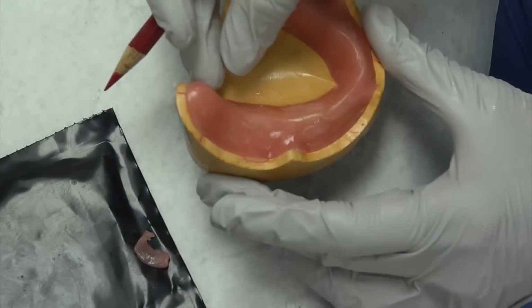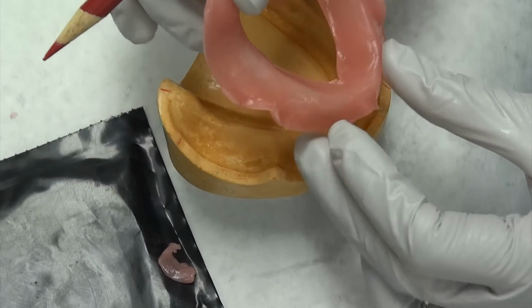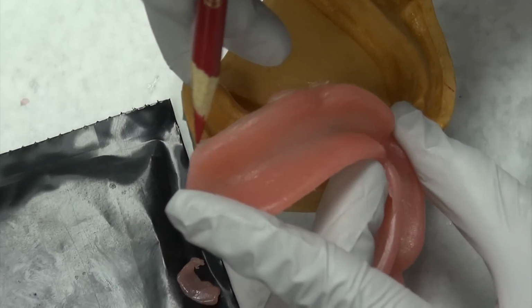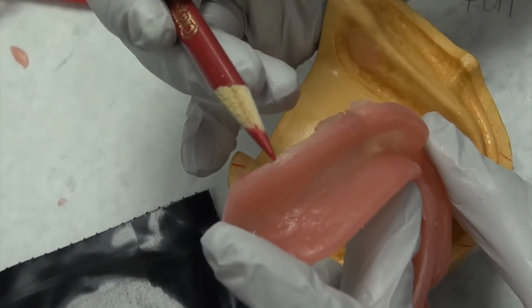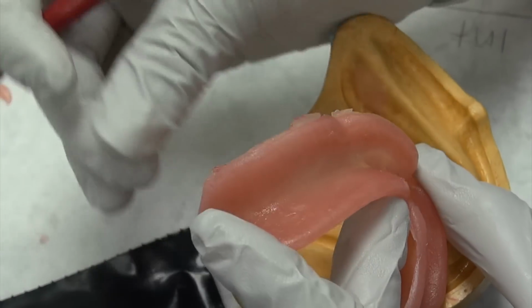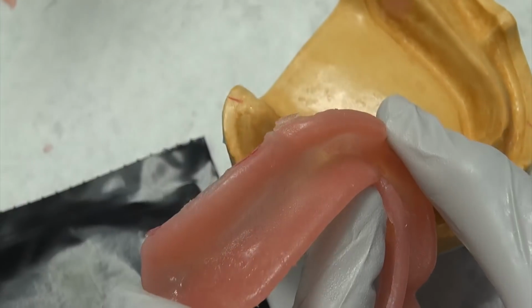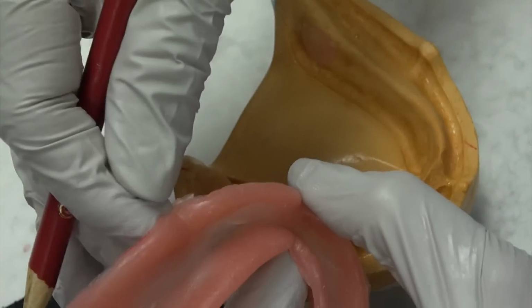Okay, so I'm gonna flip it up now. Are you zoomed in still? Okay. I'm gonna flip it so you can see what it looks like on this side. Can you see how we have nice clean borders, but there's a little area here, right? Slight. You can feel it with your finger too. So rub your finger across it right here. Okay. You can even, depending on how thin it is, flick it off with your finger. So that's a really nice part too. Okay.